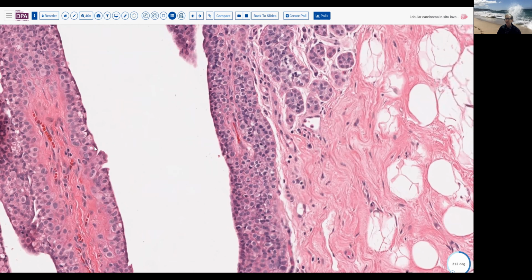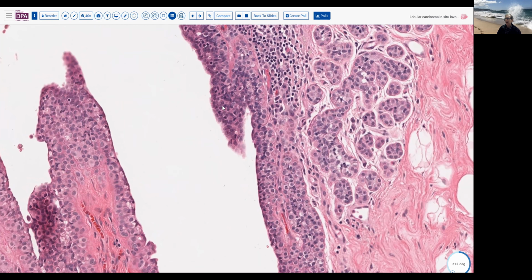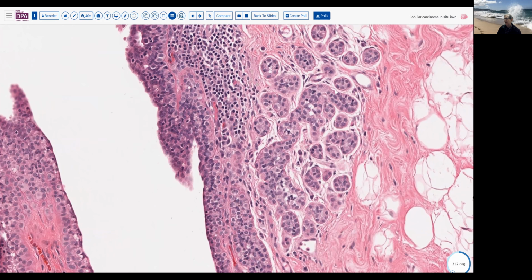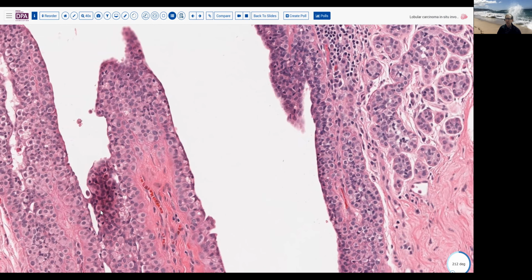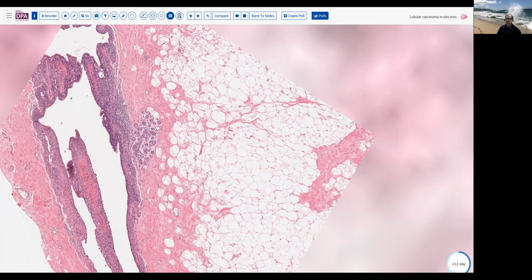They're completely displacing and pushing upward the normal ductal lining cells. And they're the same cells that we're seeing here in this little lobular space. So in reality, this is not atypical lobular hyperplasia. In this setting, this is lobular carcinoma in situ, and it's lobular carcinoma in situ that is extending in pagetoid fashion into this subareolar duct.